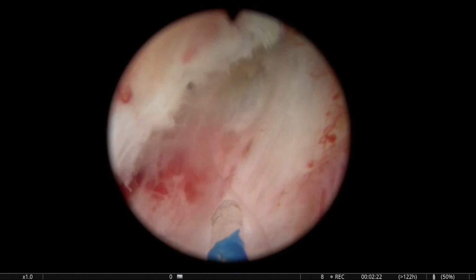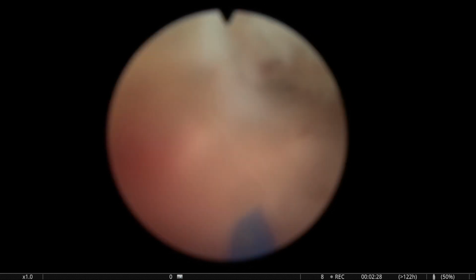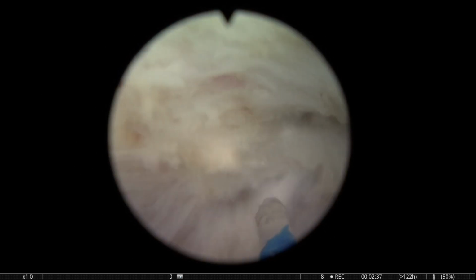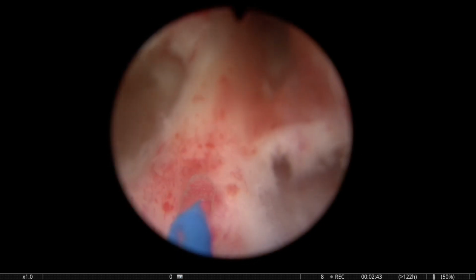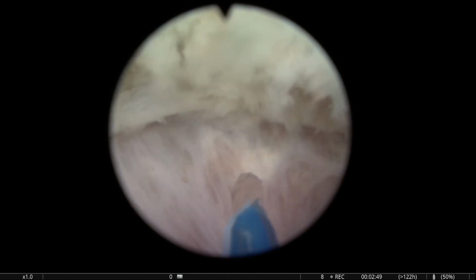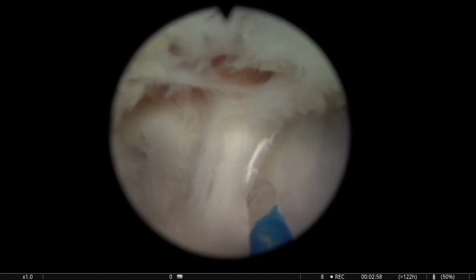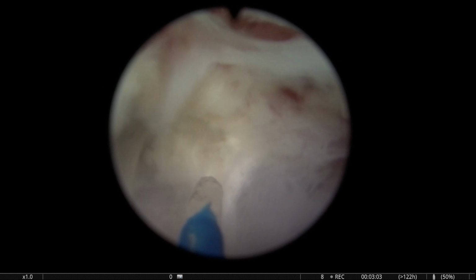and I have seen a case after open prostatectomy where there was only a big nodule hanging from the bladder neck, and the fossa was perfect. And I didn't try to look for the plane because it was absolutely obvious that there was no adenoma left inside the fossa, just in the bladder neck and, let's say, median lobe growth. In every redo case, I do the white line, and I try to look for a circumferential liberation, because even in the areas that looked as if they were resected properly, there is always residual tissue. So I go for a circumferential removal of the adenoma.